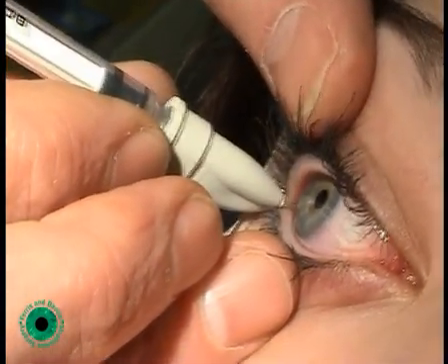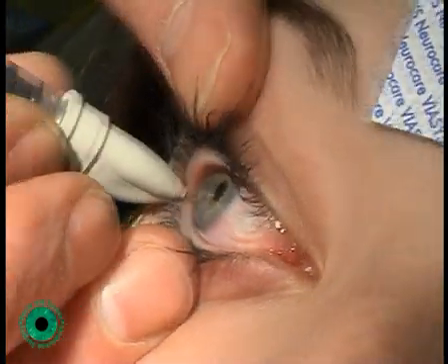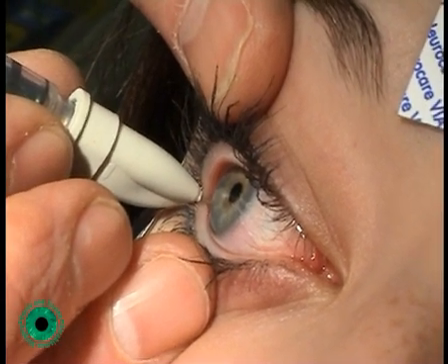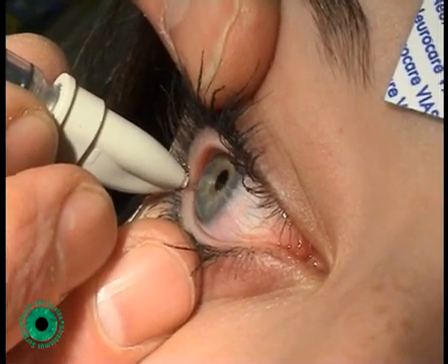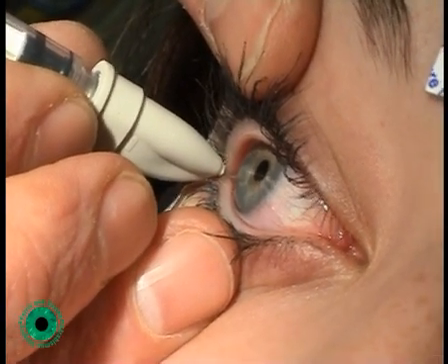We leave the needle in situ for approximately 30 seconds to minimise the spread of the botulinum toxin out of the muscle into the surrounding tissues. This treatment has been performed on a 14-year-old girl who has a sensory exotropia.